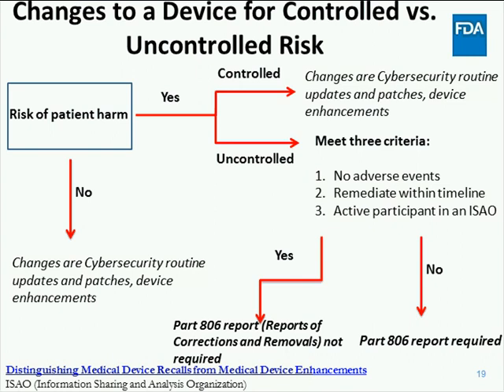In some cases, the assessment may determine that the vulnerability may present risk of patient harm, but the risk is mitigated by the presence of controls, such that the risk is reduced to an acceptable level. In general, the concept is that if there is risk, then it's controlled.